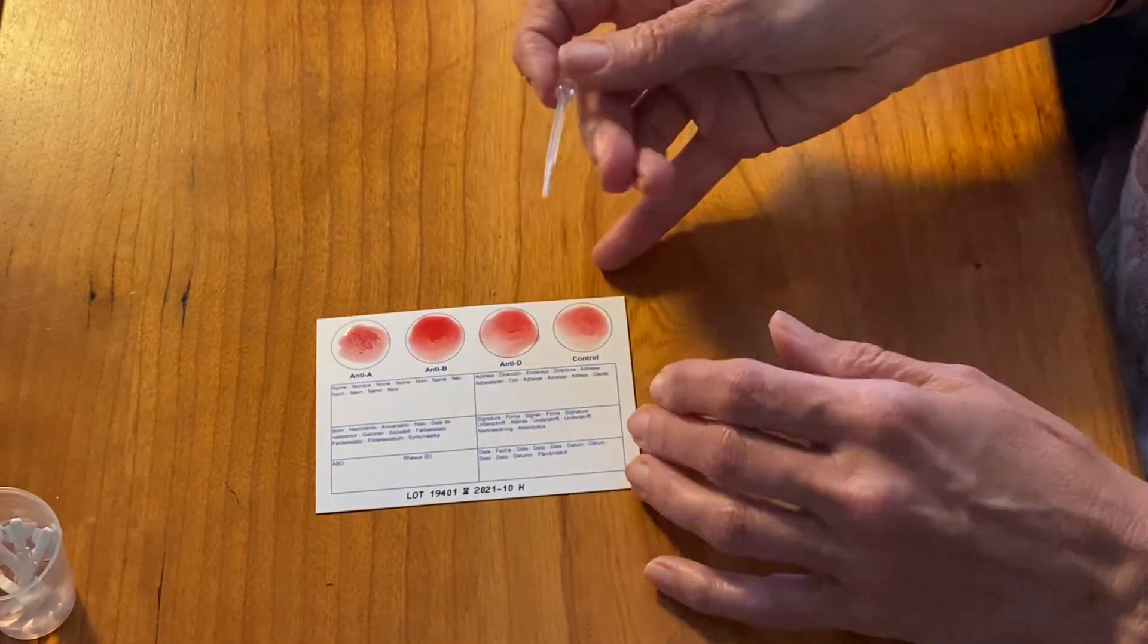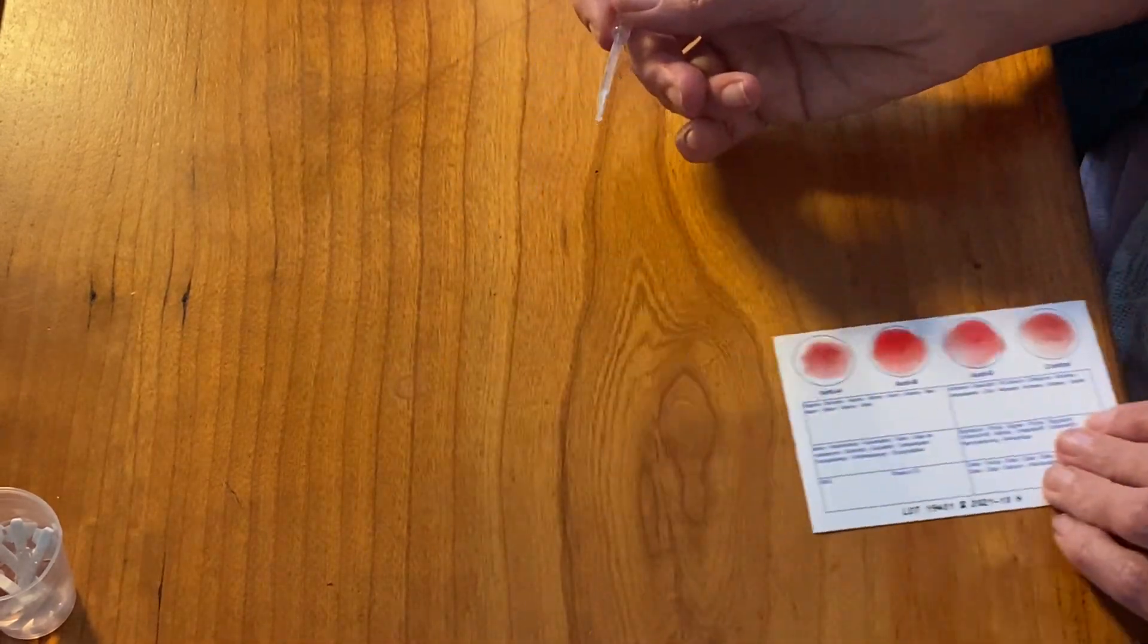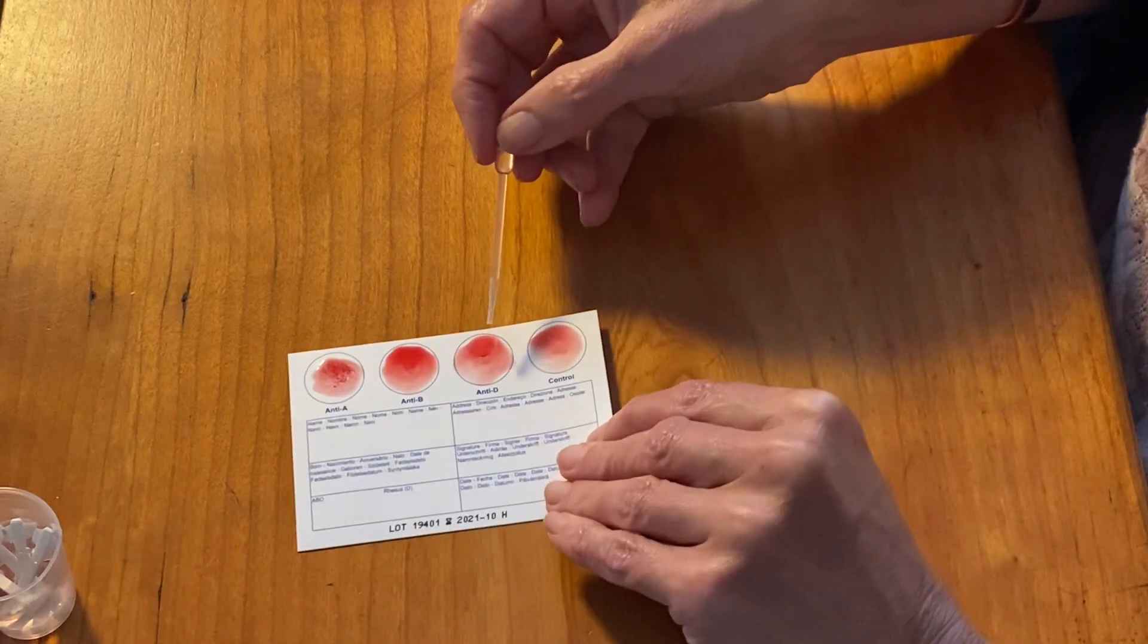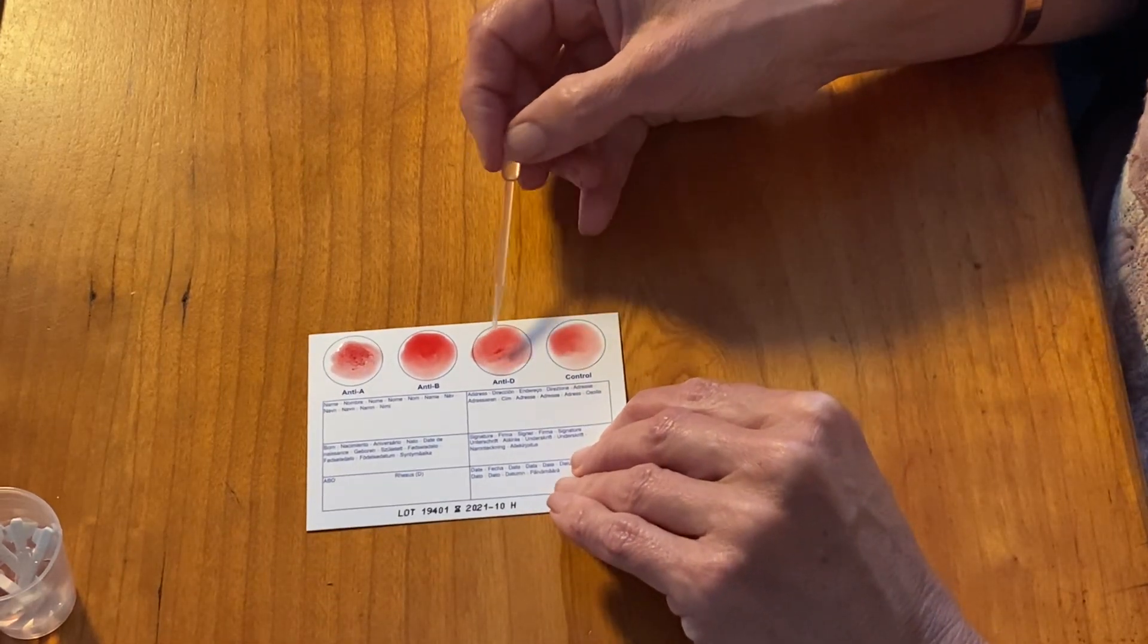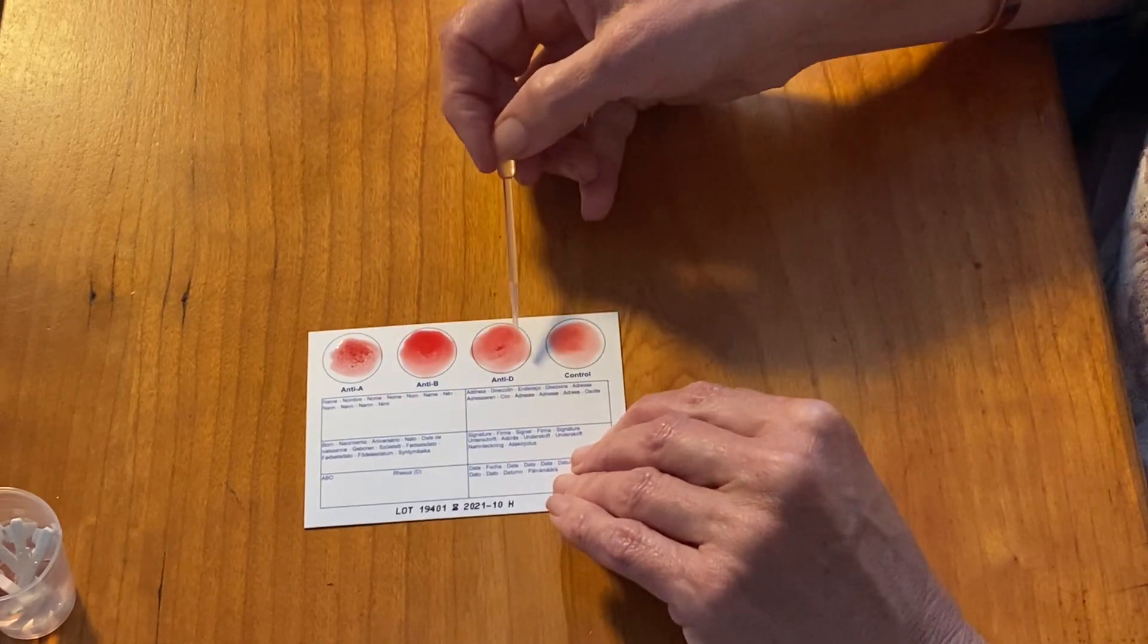As you can see, the coagulation is very strong there. The coagulation for the rhesus isn't as strong but it's definitely there. I can see that coagulation there. So that means I'm A positive.